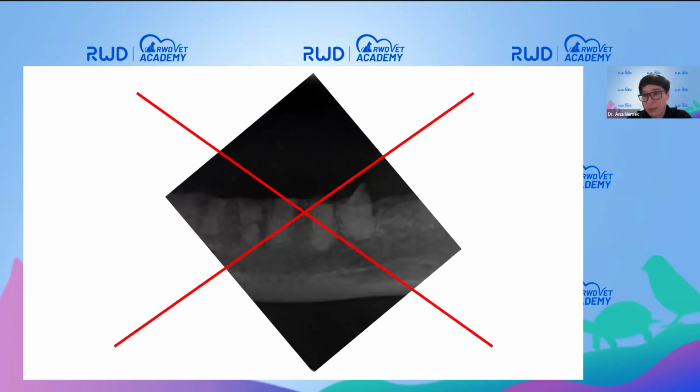It is unacceptable to perform crown amputation with intentional root retention on type 1 lesions. If we see periodontal ligament space radiographically, we have to remove the teeth. The reason is that if we don't, these roots will act as foreign bodies and will continue to cause problems.